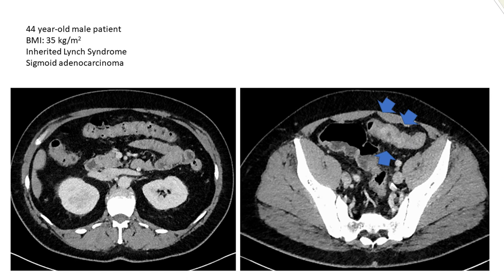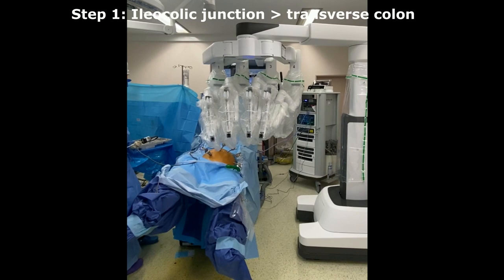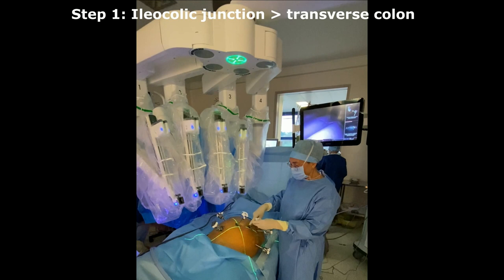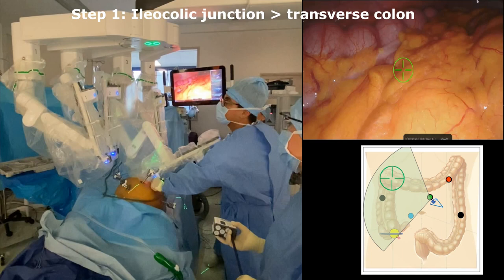Our approach for total colectomy is presented in this surgical film. We present the clinical case of a 44-year-old man diagnosed with a sigmoid adenocarcinoma revealing an inherited Lynch syndrome. The patient was positioned in the supine position, both arms tucked alongside with legs apart. The robotic cart was driven and docked on the left side of the patient, and the surgical assistant was on the left side for the first part of the intervention. The robotic arms were automatically deployed, the boom correctly positioned using laser crosshairs pointed to the camera port, and a zero-degree endoscope was inserted and targeted toward the hepatic flexure. The auto-targeting feature was activated identifying optimal arm placement, and the remaining arms were subsequently docked with instruments inserted under direct vision.